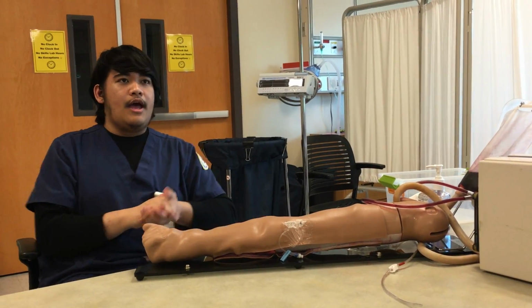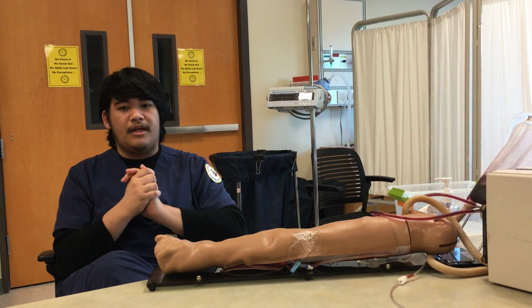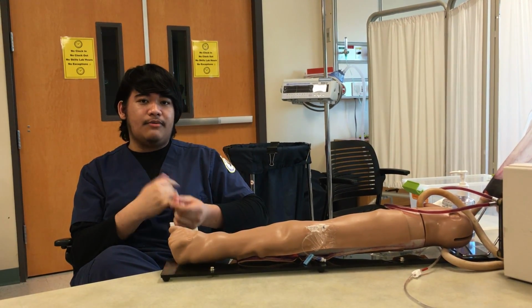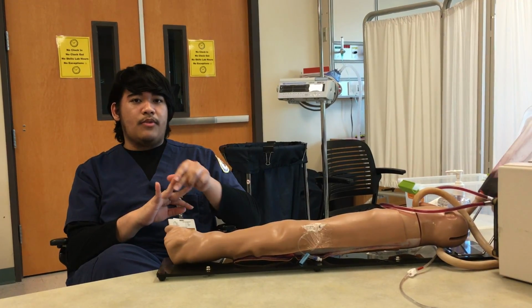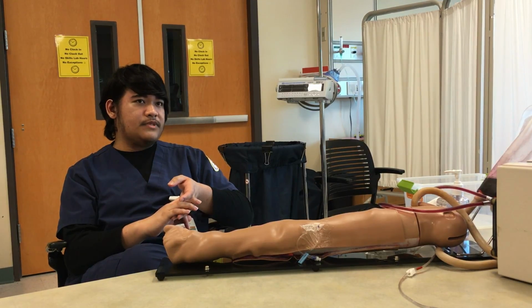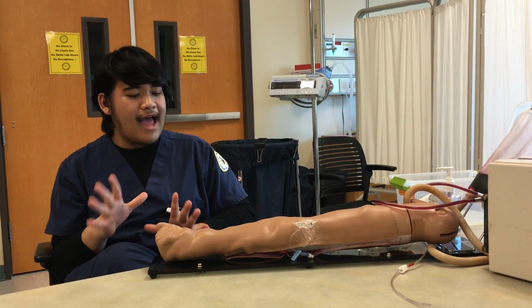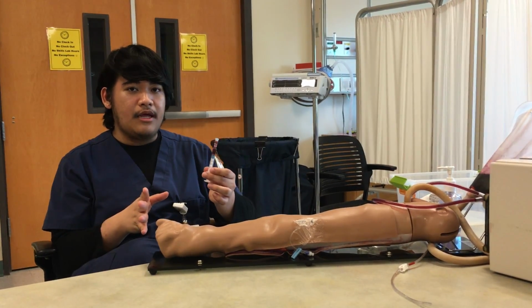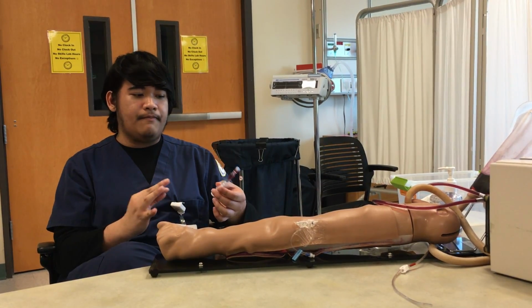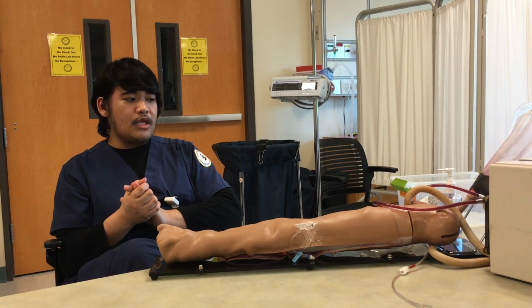Three non-invasive alternatives for this test are a transcutaneous blood gas monitor, capnography, and pulse oximeter. And then some reasons for the variations of sample size is if the analyzer needs more blood, we would get more blood from the patient, or if the nurse and the physician need more blood for testing, we would get more samples.